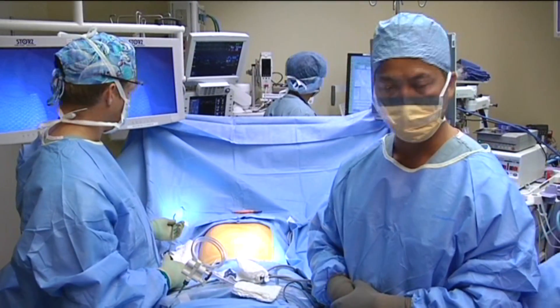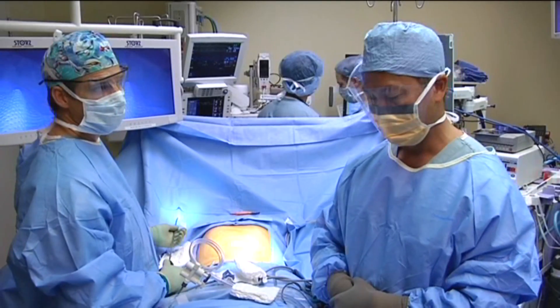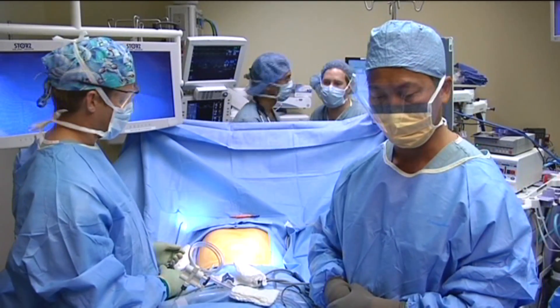So if you're ready, let's move on and go into the operating room. Welcome again to the University of California, Irvine Medical Center. Today's case is single incision laparoscopic cholecystectomy.